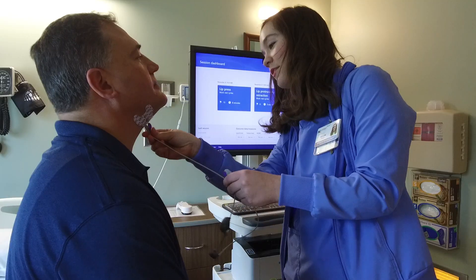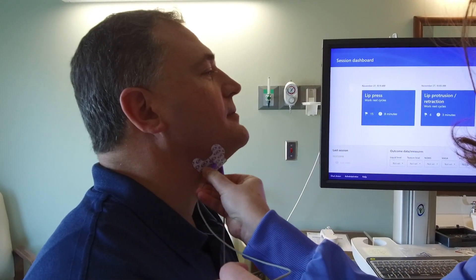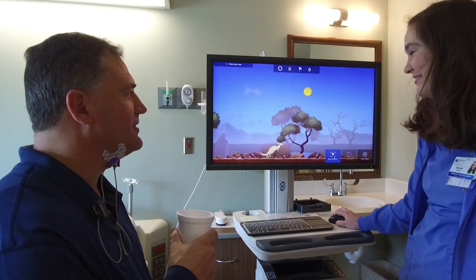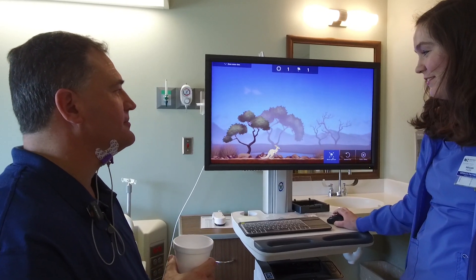Dysphagia is the difficulty swallowing, and it's very common in the inpatient rehab setting after patients have strokes or brain injuries. The Synchrony dysphagia system works on providing visual biofeedback to the patient so they can actually see their swallow. In the past we have been doing general swallowing exercises, but the patients weren't able to see the progress — whereas with the Synchrony, it turns it into swallowing games.